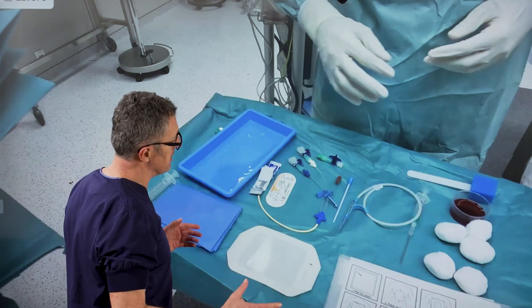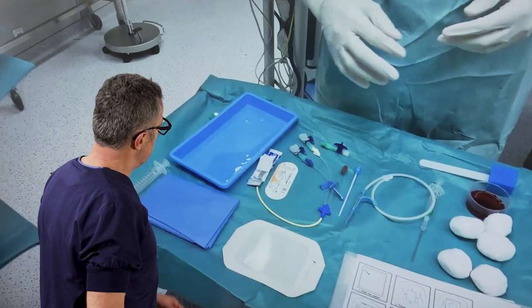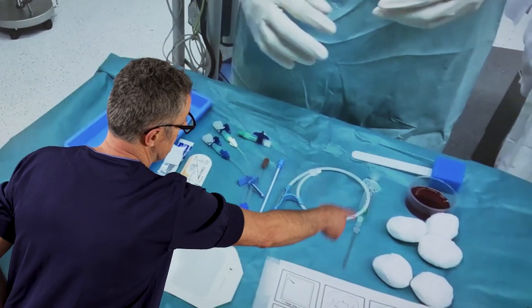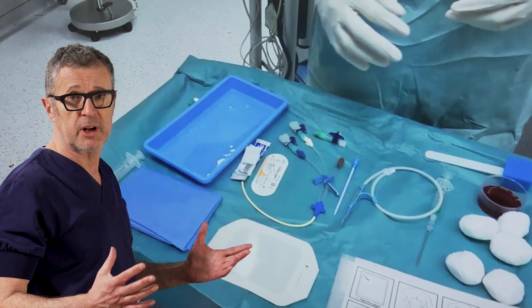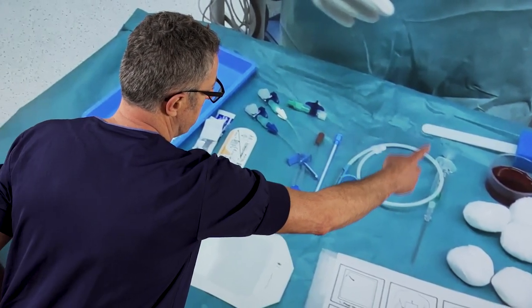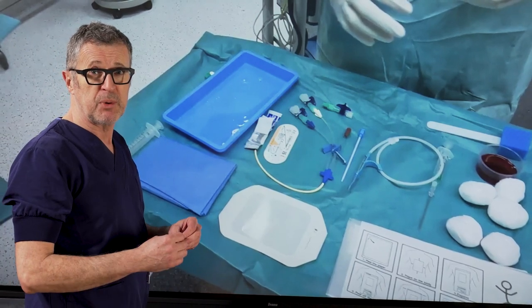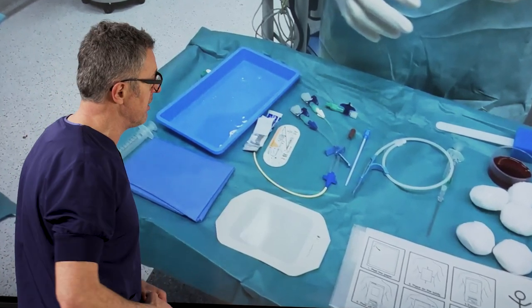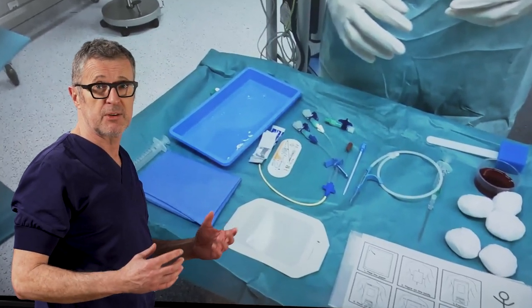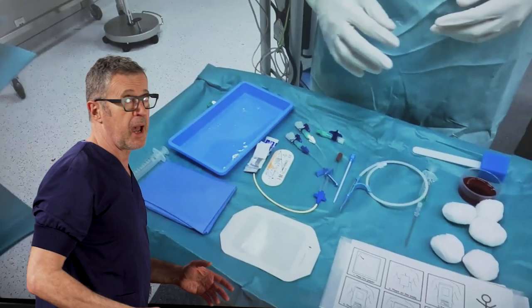What we see here is a typical central line set that is on a tray. Here we can see fluid for irrigation. That is the needle we're going to use to insert into the subclavian vein. Then we're going to pass the guide wire through that needle to keep it securely inside the lumen of the vein. That is a dilator, which comes next so we can dilate the skin through which the triple lumen central line catheter is going to pass.